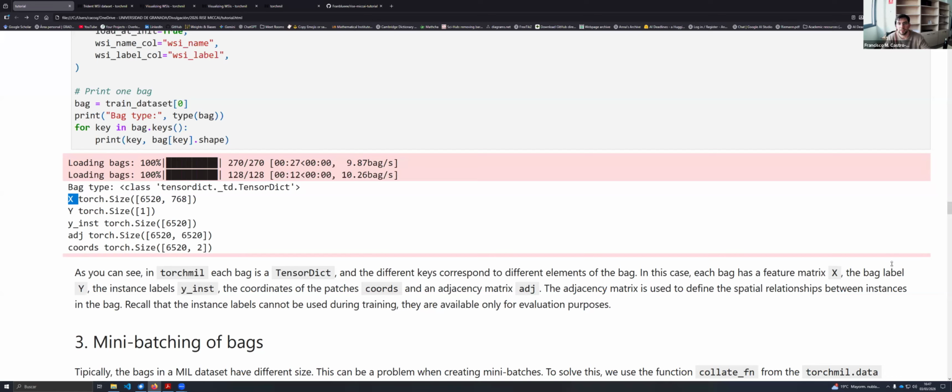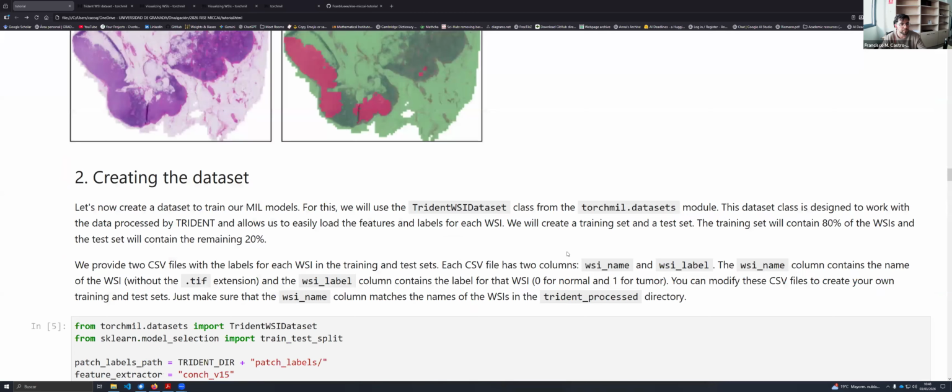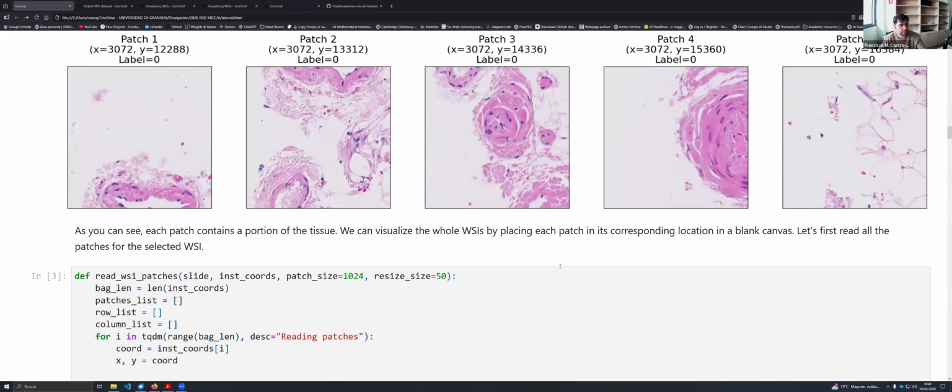Okay, I see two questions and I think someone raised their hand. So let me first answer the question. It says, how do you assign the patchwise label? Do you use the slide label? Let's say we have MIL with 58 slides, which can have numerous patches. Do we then extract the patches and just assign 0, assuming this is our label? Okay. How to assign the patch label?